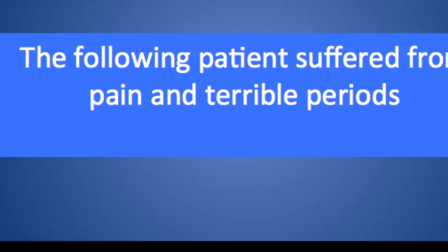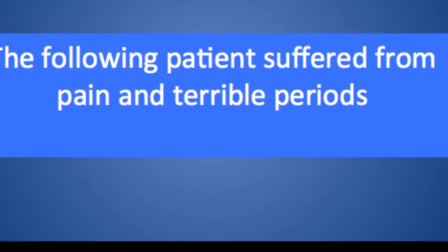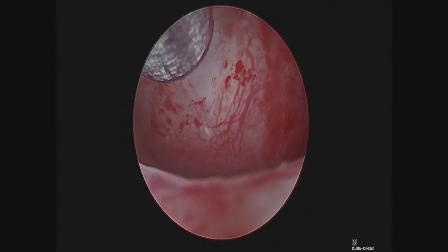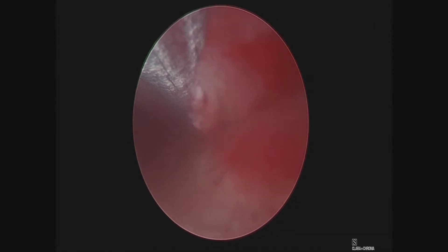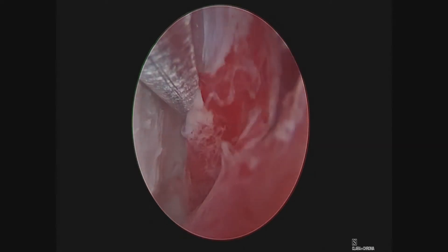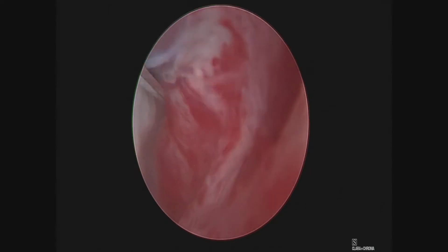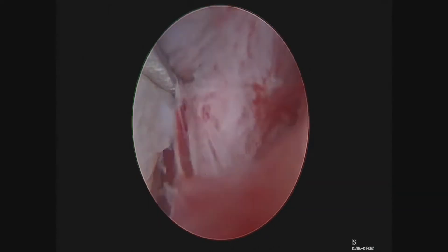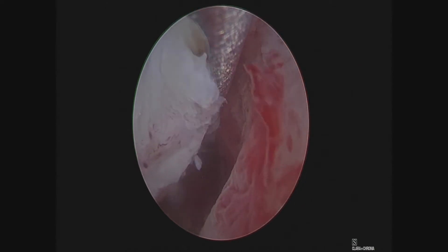The following patient suffered from pain and terrible periods. She had a fibroid that was within her uterine lining. You can imagine a fibroid like this, taking up almost the entire endometrial or uterine cavity, can also interfere with fertility. There is no place for an embryo to implant when a fibroid is taking up the entire cavity.